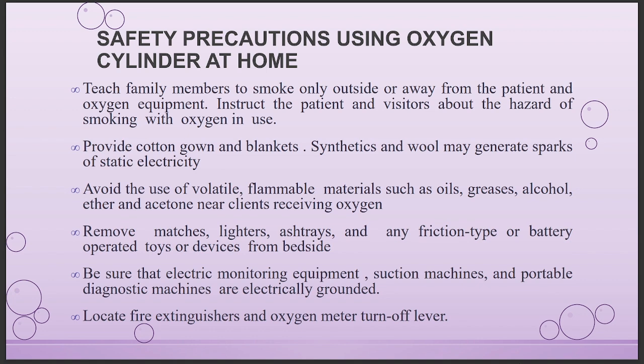Be sure that electric monitoring equipment, suction machines, and portable diagnostic machines are electrically grounded. Locate fire extinguishers and the oxygen meter turn off lever.